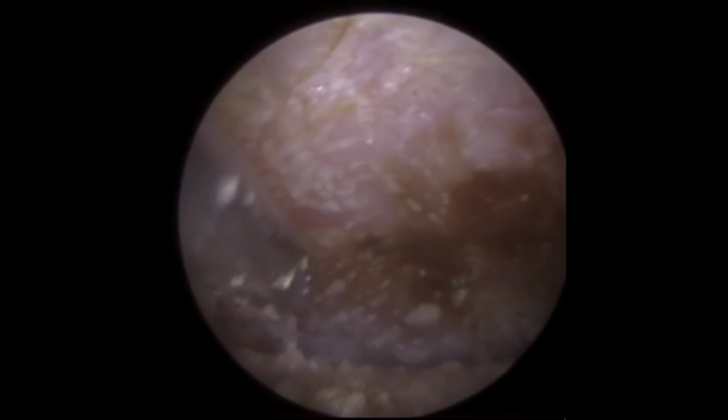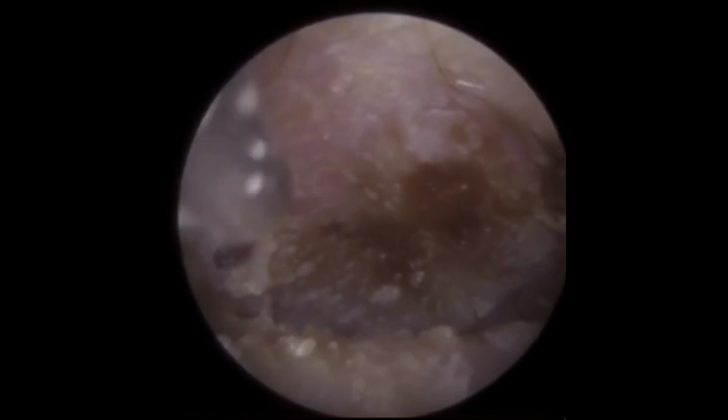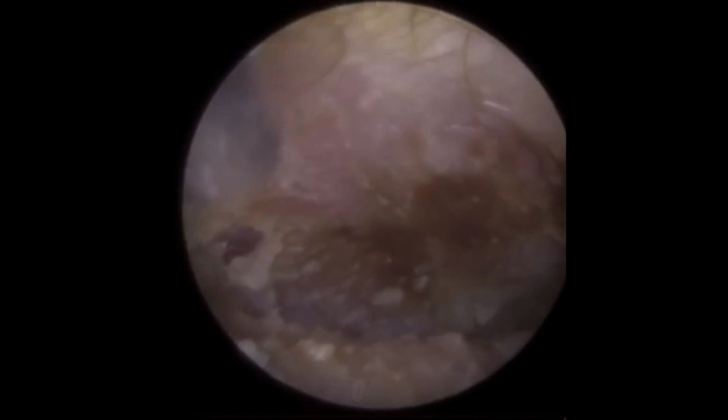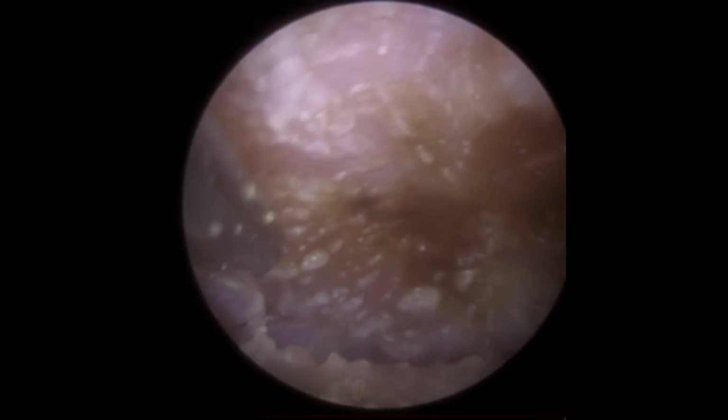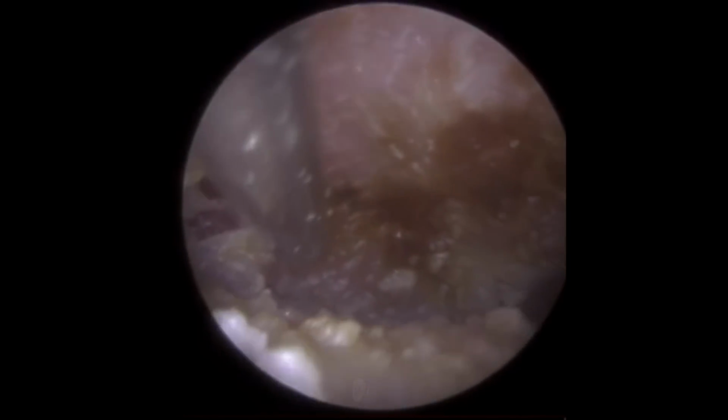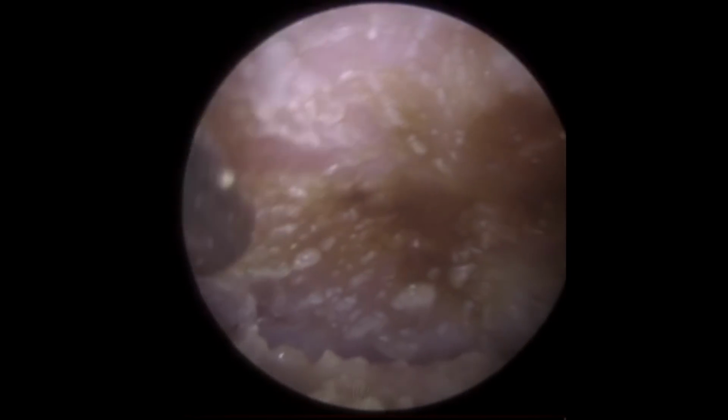So underneath this dead layer of epithelium skin cells, you've got a fresh layer of skin cells that are healthy and intact. So by going in there and spinning it, you're going to be grazing and causing damage to these skin cells. So in the UK, at least, obviously every country is different, but in the UK, it has really fallen out of favour.